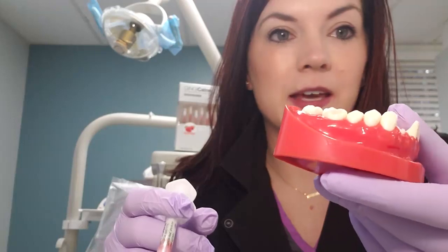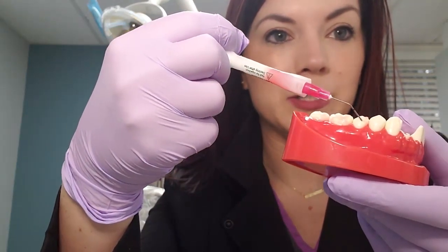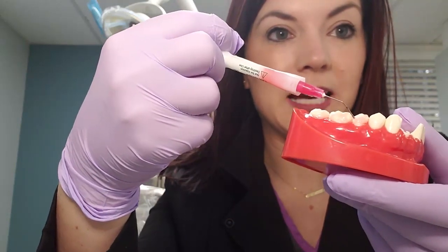For demonstration purposes, what I've done is I've taken a little bit of the gel and I've put it right onto the tooth here. I'll put a little bit more so you can see. Because it has that little pink color to it, you're going to be able to see exactly where you've applied it.